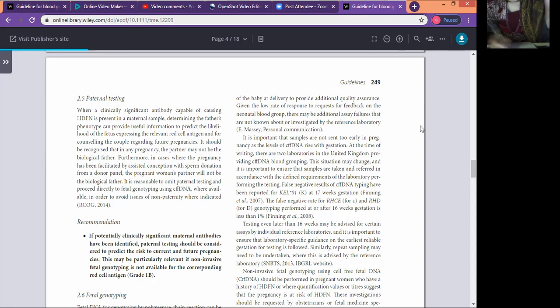And this uses the national standard. Firstly, the equipment is the flow analyzer. It uses this national standard by the NIBSC control, and then the results are labeled as international units per ml, and they are then compared with previous samples or results that may have been obtained.